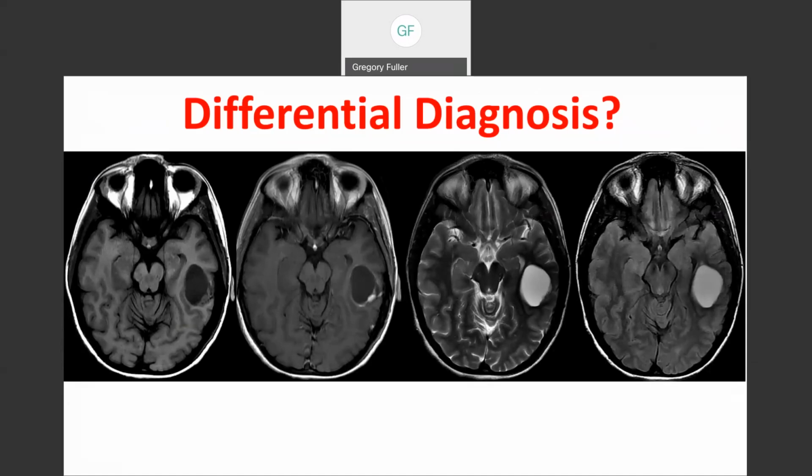All right, you can see this tumor is localized within the left temporal lobe. It is sharply circumscribed. It is cystic. You can see that on the T2 and the T2 FLAIR. And if you look at the second image here, the T1 post-contrast on the left, it has an enhancing mural nodule. Now it's a little messy. It's not a beautiful sphere, like a nodule is a sphere, but there's an enhancing component, right? And you can see that in negative relief on the T2 and the T2 FLAIR.